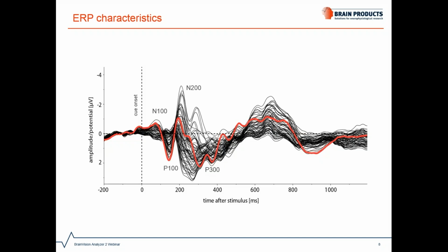Hence, the P300, or P3 in short, refers to a positive deflection around 300 milliseconds after the stimulus. Note that ERPs are by convention often plotted negative up, like here, which means positivity is reflected downwards and negativity is pointing upwards. The two main features of an ERP that you could quantify are the amplitude and the latency of a component.